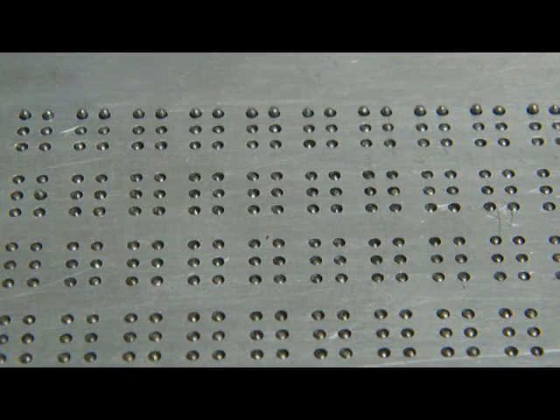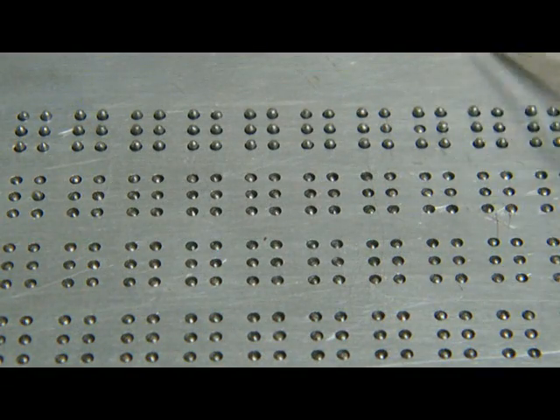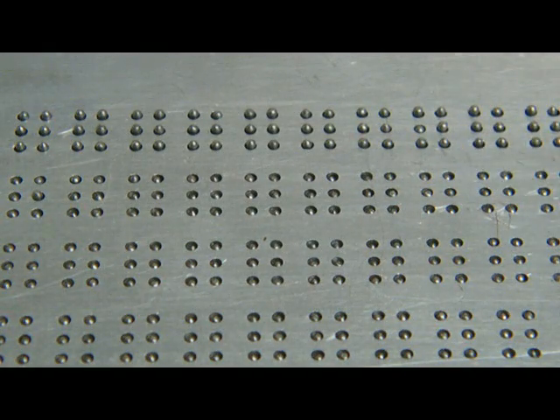Now I'll do it for the second. I'm keeping that line up. I'm doing for the second and third. So now if you can see, all the cells in this top line are up. There seems to be one that's stuck over there, but that doesn't really matter. Okay, there. That one's a little stuck. It's a little lower than normal, but if you can see, all the pins are up.